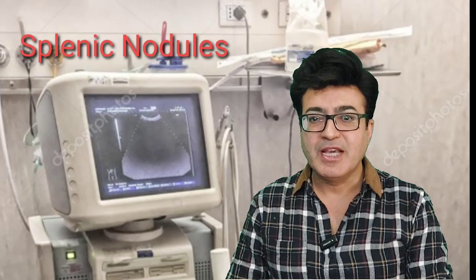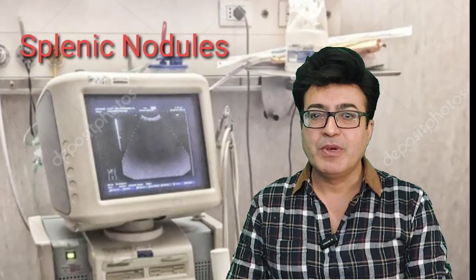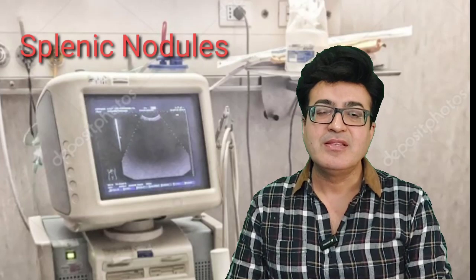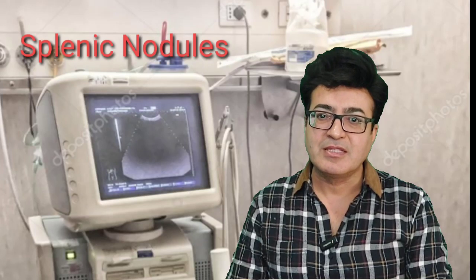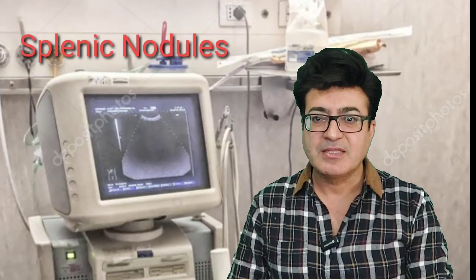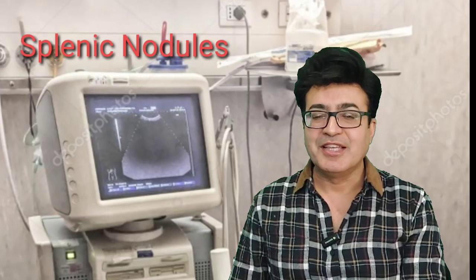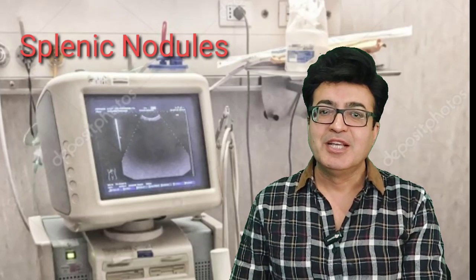There are multiple differentials for splenic nodules. On the top of the list are infections, especially Mycobacterium tuberculosis and histoplasmosis. These are the commonest ones. Bacterial infections are also very common and cause microabscesses, and besides this, lymphoma and metastatic disease are also on the list. Nodules happen to be of different sizes. As I mentioned earlier, there may be micronodules, and there may be nodules larger than 3 centimeter.